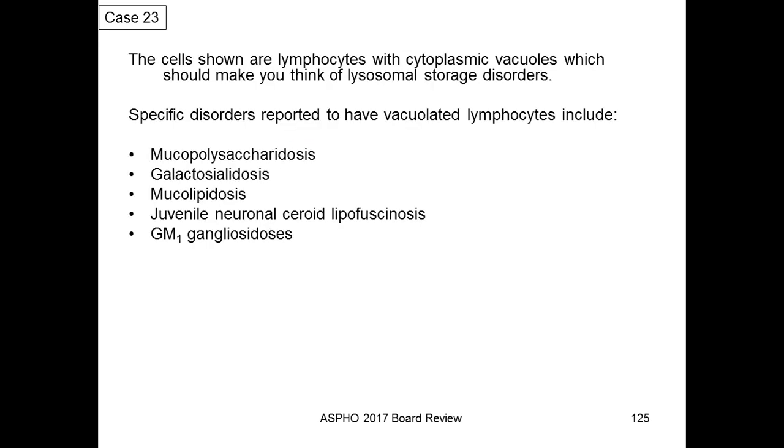So there are specific disorders in this category of lysosomal storage disorder that are associated with vacuolated lymphocytes. So this particular photomicrograph that I took was a patient with galactosialidosis. But in general, if you see lymphocytes with prominent vacuolization, you should think of potential lysosomal storage disorder.